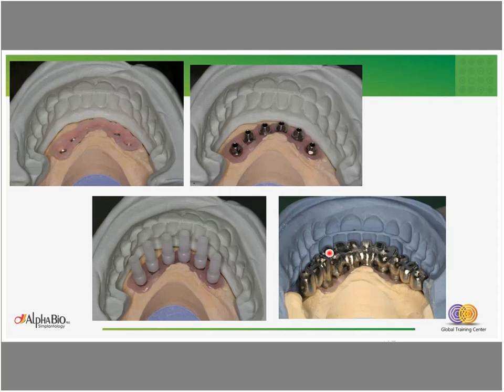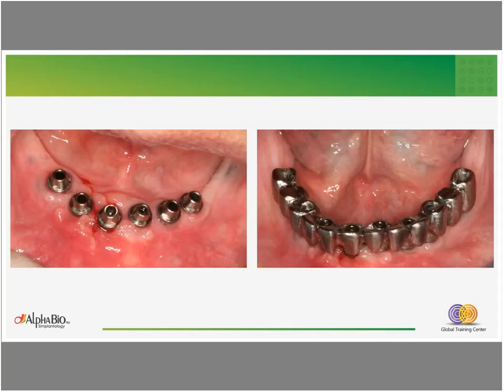This is the metal framework. And this is the final restoration, screw-retained restoration with bilateral cantilever. The restoration is connected to the implant via the abutment, the multi-unit abutment.